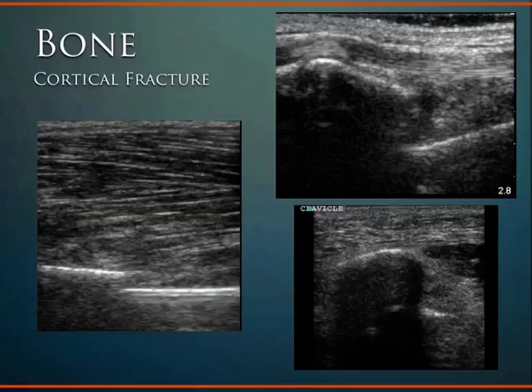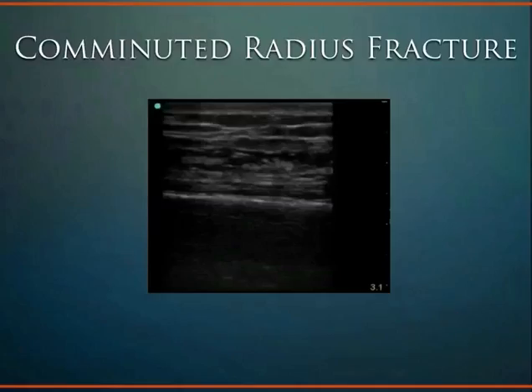When you get a good sense of what that looks like, and then you look at fractures and pathology, it becomes quite obvious, where you have that discontinuity, what people refer to as step off. It'd be nice if they were all this obvious. They're not always that obvious when you're looking at that top right picture. And then this distal clavicle fracture shows a very common step off type appearance and displacement of the bony fragments.